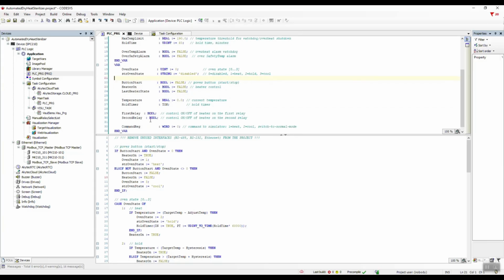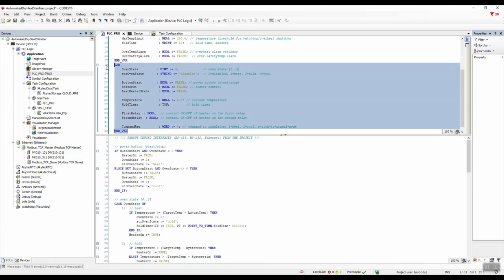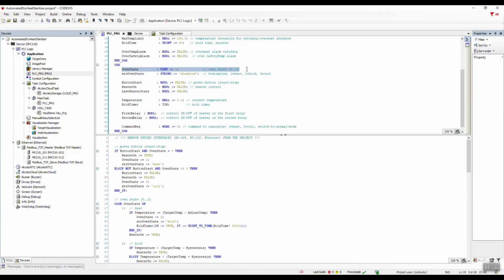Now, about these variables, which we don't need to store in non-volatile memory. Their values will be generated in our program. Sterilizer status, 0 means off, 1 is heating, 2 is holding temperature, 3 is cooling. Sterilizer status has a string for visualization display. Start and stop button for the sterilization process, used in the visualization.